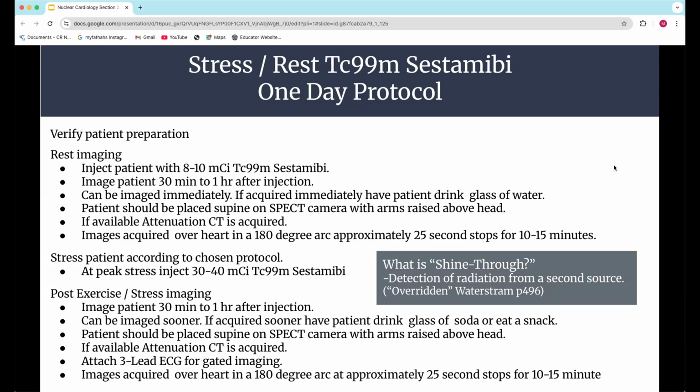What's happening there is your camera detects the hottest pixel, and then it makes all the shades of gray go down. That hottest pixel is white, and then all the shades of gray down to black are represented from less radiation all the way down to black, usually being no radiation or some version of that, right?